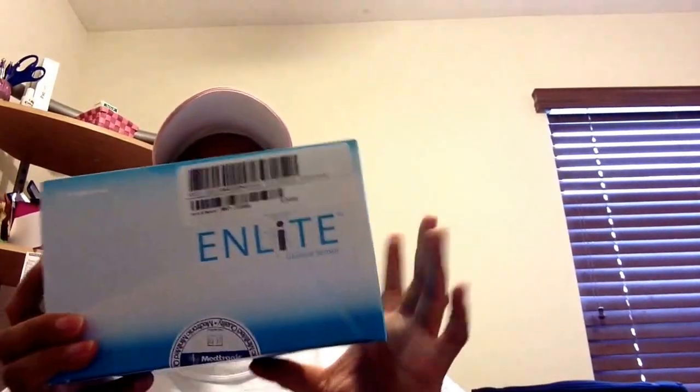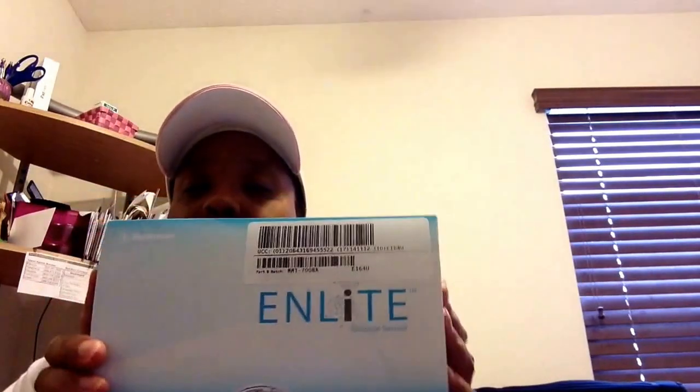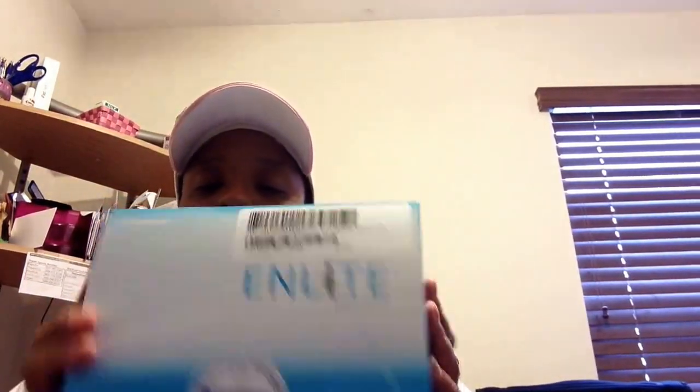Then in the next box that came with it — the smaller box I showed you first — I received the glucose sensors, the Enlite ones. This is what I'll have attached to me; this goes in first. I've got three of those boxes. The boxes are pretty — I don't know why they're changing them because these are cute boxes. There are five sensors in each box.